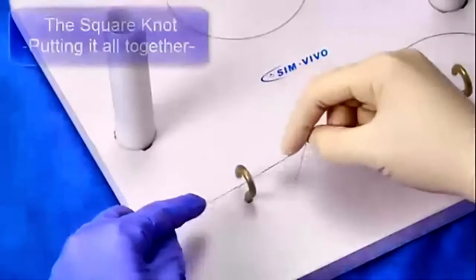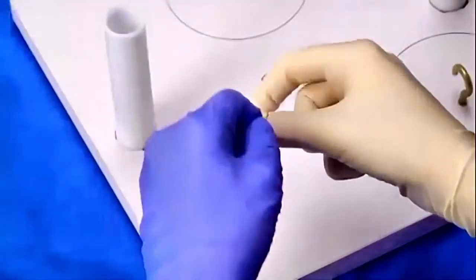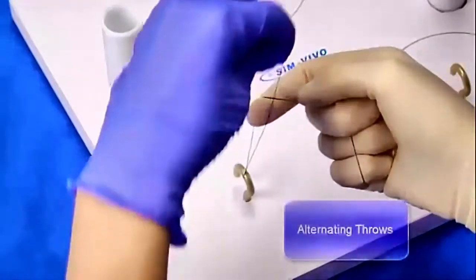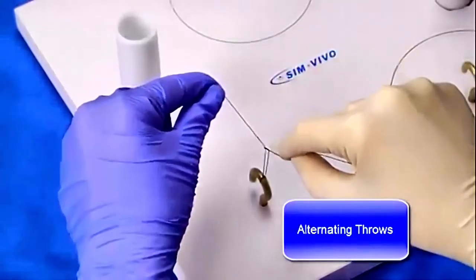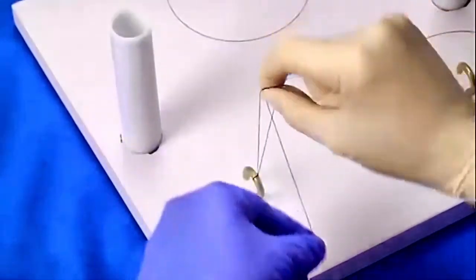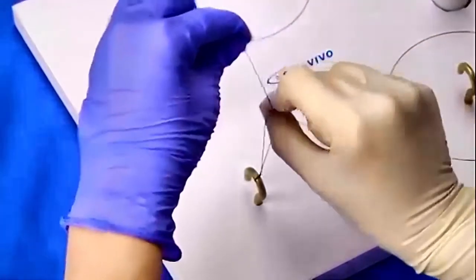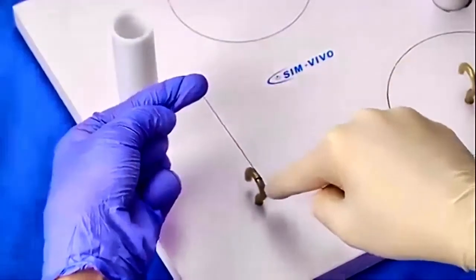Let's put it all together with alternating throws for a square knot. First of all, use your thumb as a post. Bring the suture down with your index finger securely. Now use your index finger as a post. Bring the suture down with a slight rotation of your hands. Now your thumb as a post. Again, bring the suture down with your index finger for security. And finally, use your index finger as a post, and you have completed 4 alternating throws of a square knot.